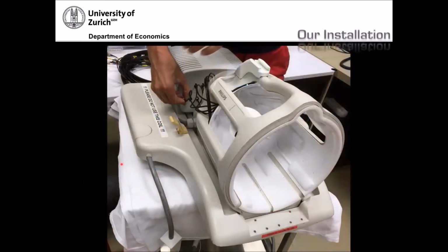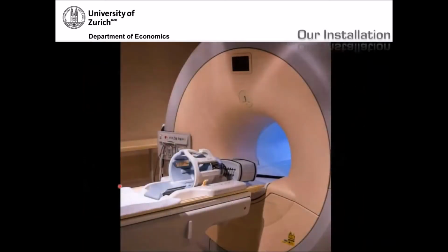But it was very important for us that the installation is pristine, in the sense that we're a neuroscience lab. We cannot have installations that look like a nuclear submarine, and everybody would be scared to go into the scanner. People should not be apprehensive when you do an fMRI study, for example. So this is our final installation. You can see the coil setup with the probes. You can maybe see those little protrusions, which are the probes underneath the insert.